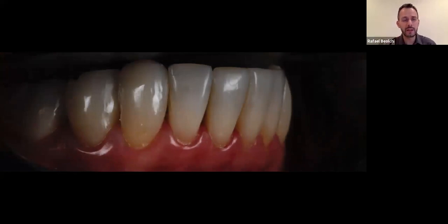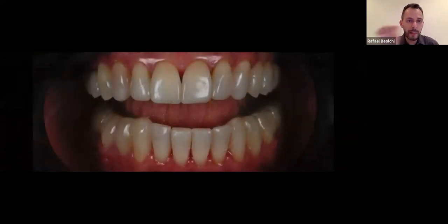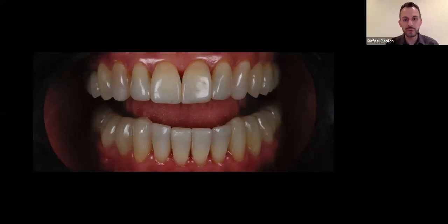This is one of the things that a good composite should do. It is to blend where it is tooth and where it is real enamel. And this is what I love about mosaic enamel colors and also dentin colors. It helps me when I do a good layering, a good overlaying actually, it helps a lot to blend, you know, so it is hard for us to see where it is who, so who's composite and who's tooth.